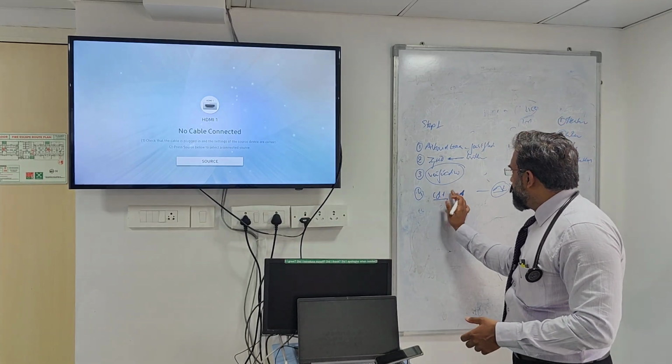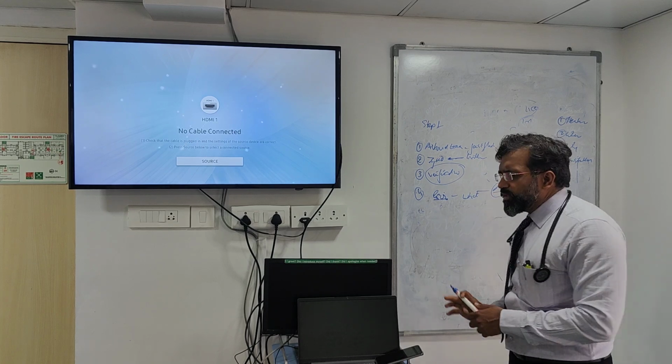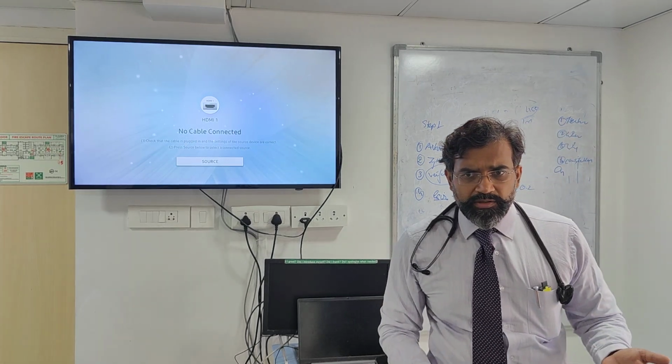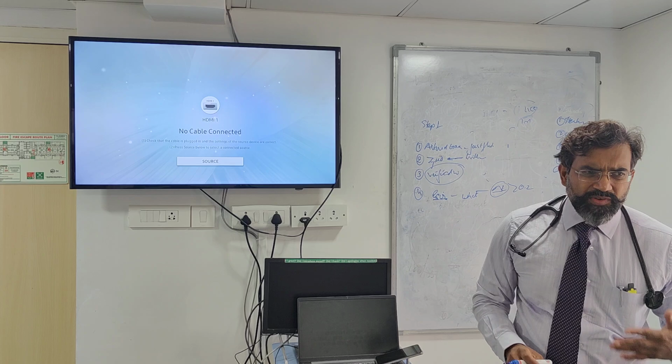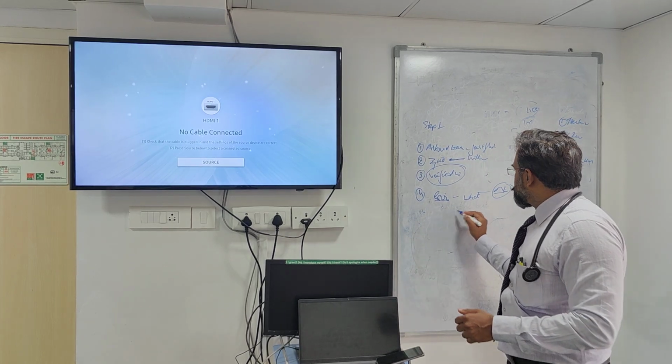So when you are coming to the how, we are coming to what is the fluid that you are going to use. You can use either 5% dextrose or you can use normal saline. Normal saline is always better because 5% dextrose will again move out of the circulation when you are going to this arm.